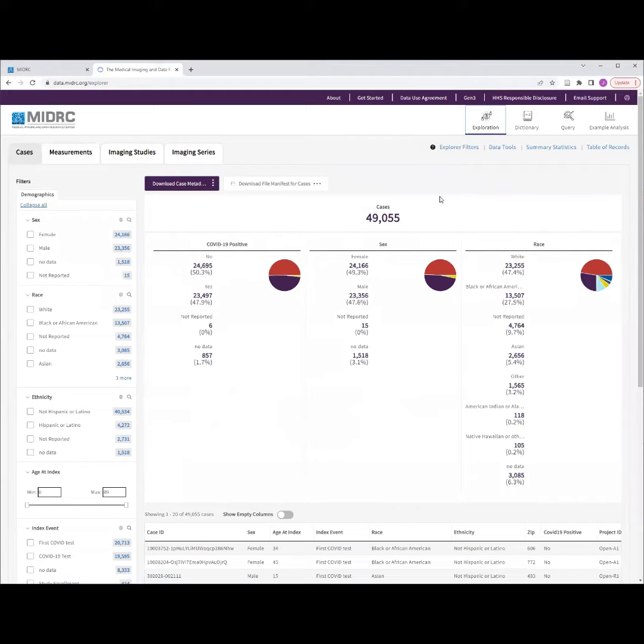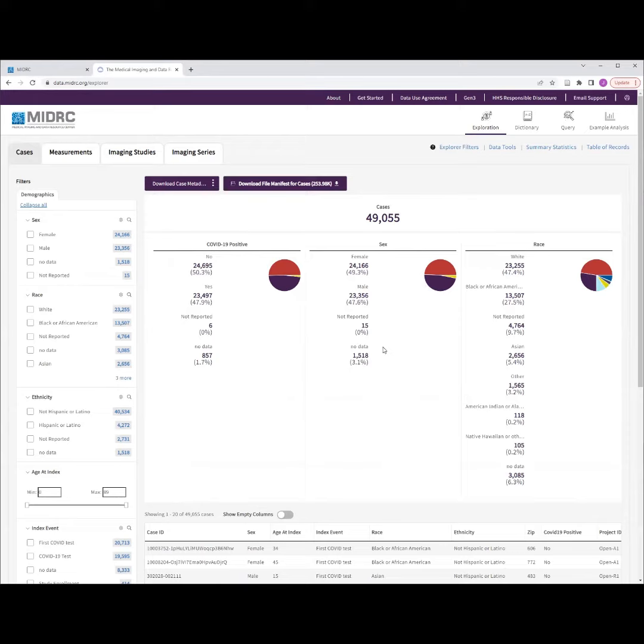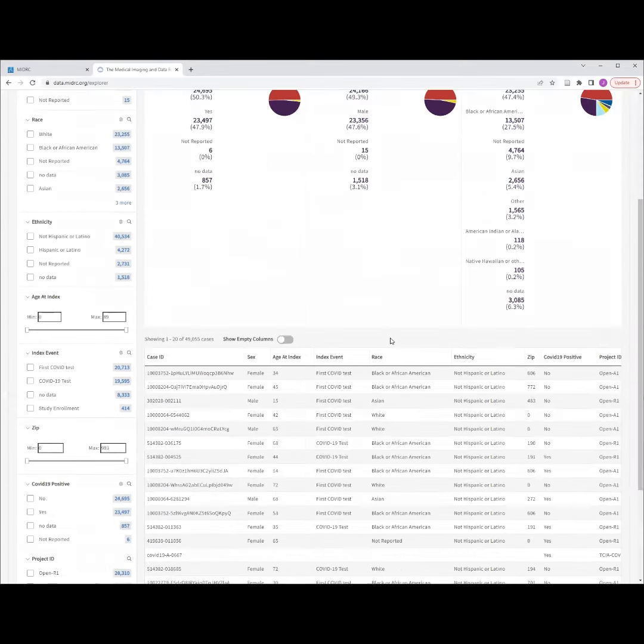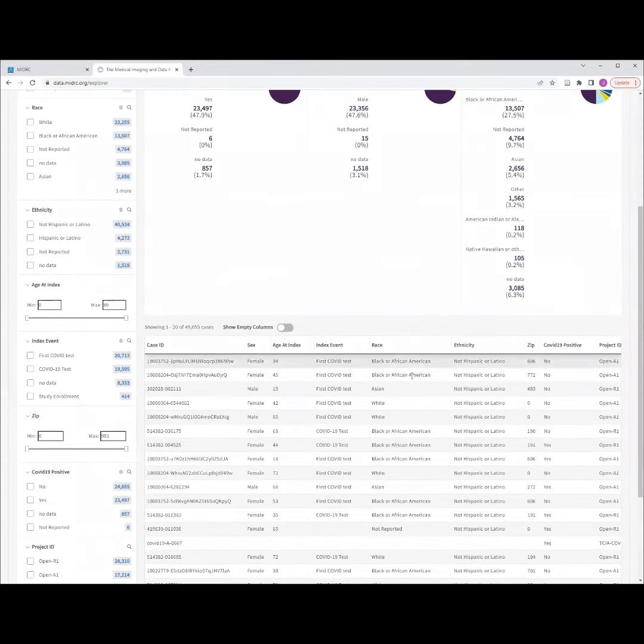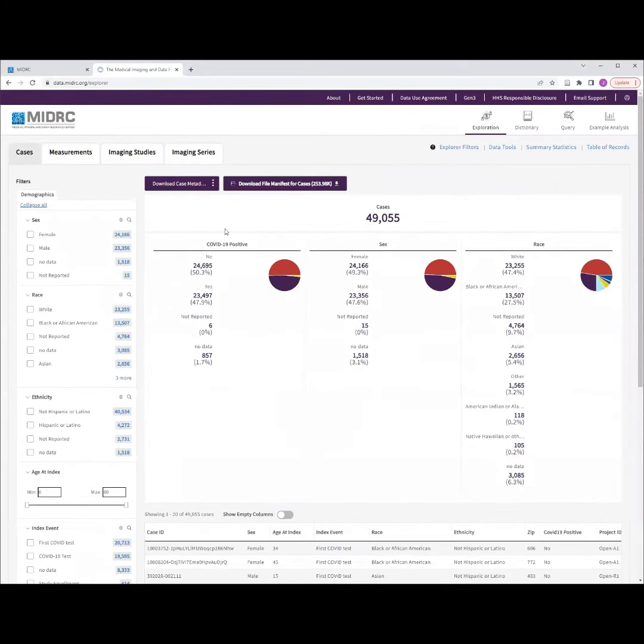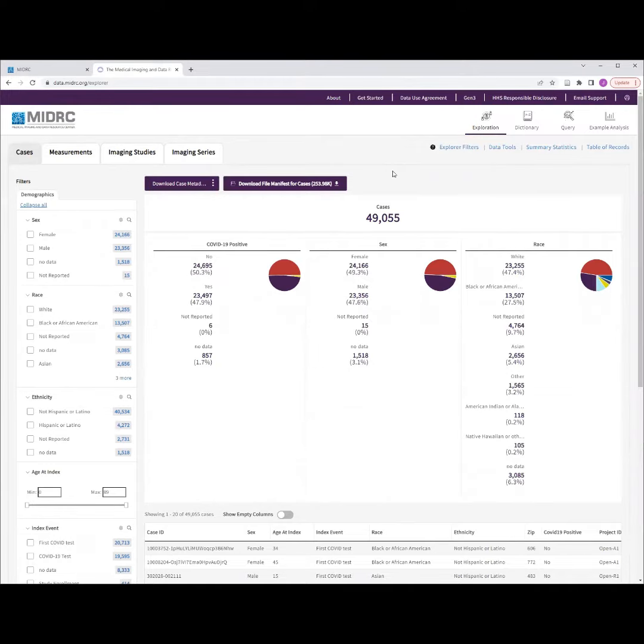There are three main components of the Exploration tool. First, in the central part of the screen, we see a snapshot of the currently selected research cohort. Below this, we see a spreadsheet of case metadata for the selected cohort, which you can download and interact with using the Download Case Metadata button highlighted here.